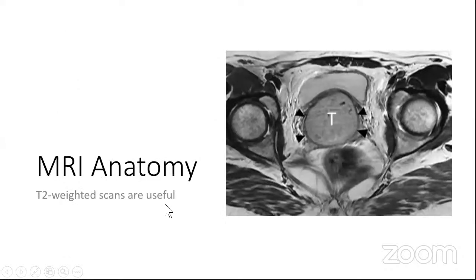Right? So coming down, I've told you that we will be taking MRI scans, CT scans, or using PET CT scans for planning. But the most important part for planning is, of course, the CT scan. We would have to take a CT scan for the dosimetric evaluation, so that is a must. In addition, we can go ahead with an MRI scan, and we can also have a PET CT scan.